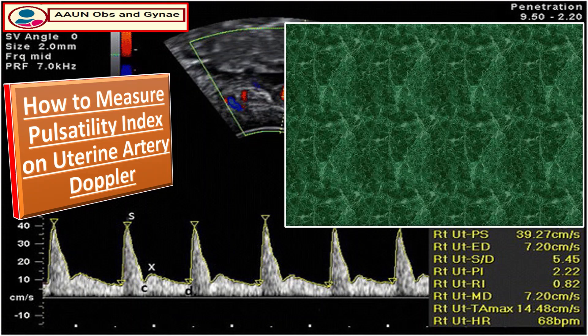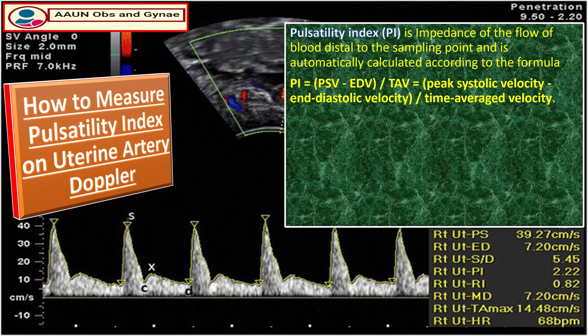The Doppler spectra of uterine flow help us calculate the pulsatility index (PI) and resistance index (RI). The pulsatility index is used as a measure of impedance of blood flow to the sampling point and is automatically calculated using the formula: PI = (peak systolic velocity − end diastolic velocity) / TAV, where TAV is time average velocity.